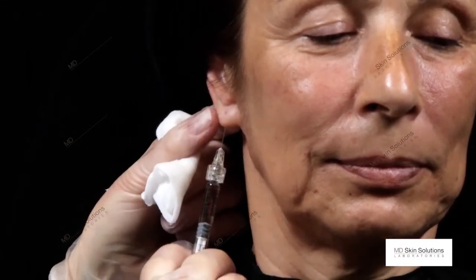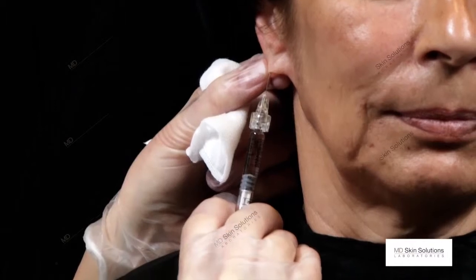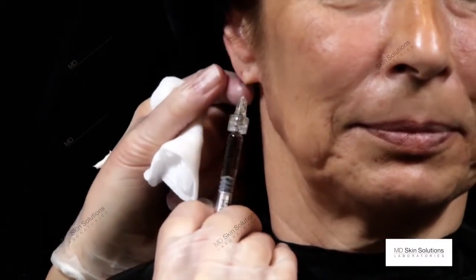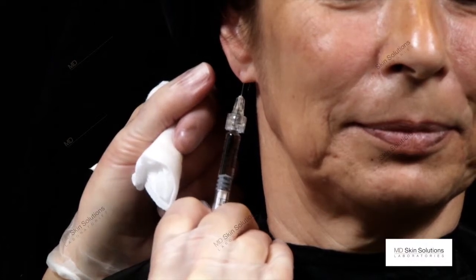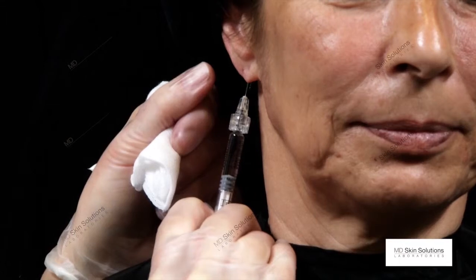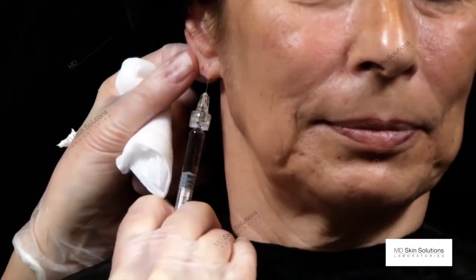We will inject the earlobe here because a loosening of volume marks an aging overall attitude, or is the giveaway for aging. So what we do here, we simply replace by Pluryal, inject slowly a kind of a bolus at the low, and the entry point is the lowest point of the earlobe.